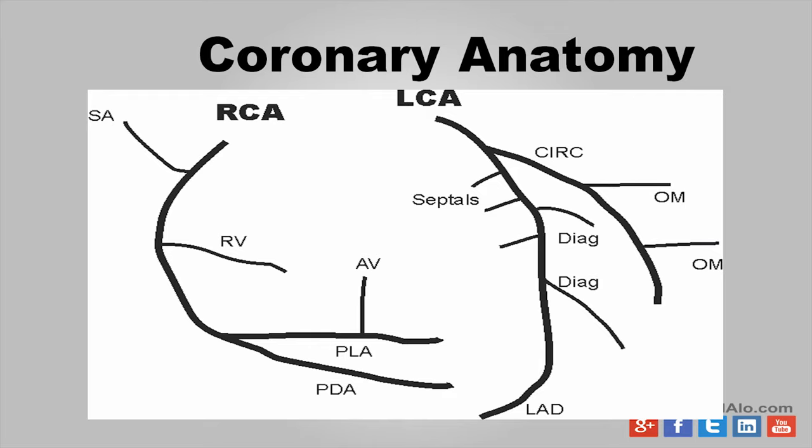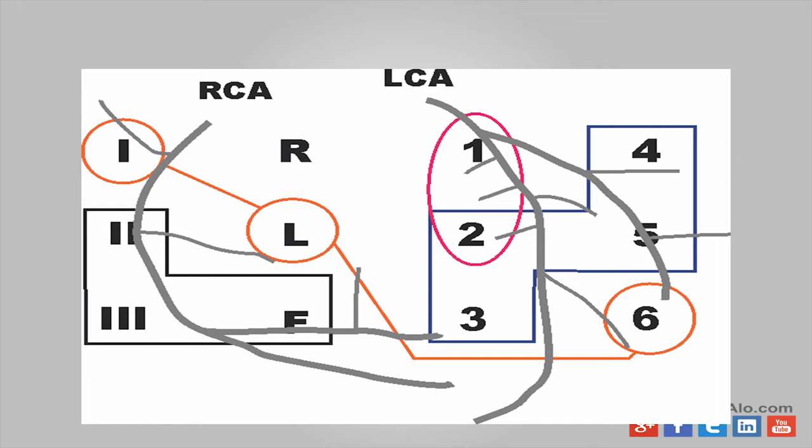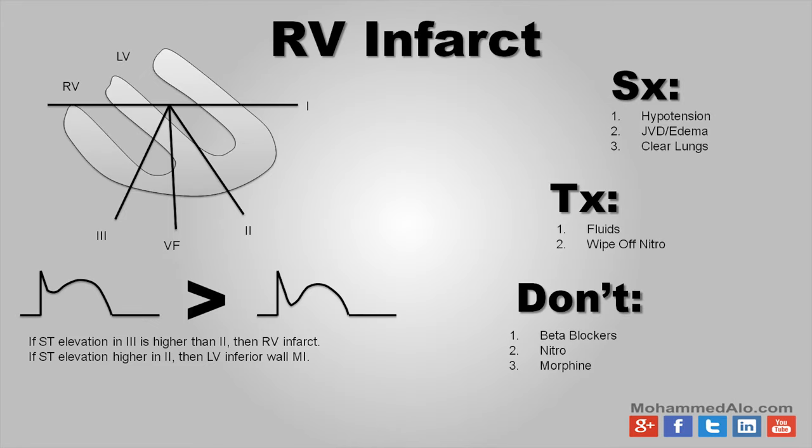So this slide, I tried to kind of superimpose the arteries with the places they go. You can see the LAD kind of goes to the anterior, the circ kind of goes out to V6 and all that, and the RCA obviously feeds the inferior stuff. So one very important type of infarct that must be discussed to separate the children from the adults in terms of medicine, especially if you're an ER doctor, you need to recognize this right away, especially if you're a cardiologist or a medicine physician as well. But RV infarcts are very, very important. If you have an RCA infarct high enough, you affect the RV branch and it knocks out your RV.